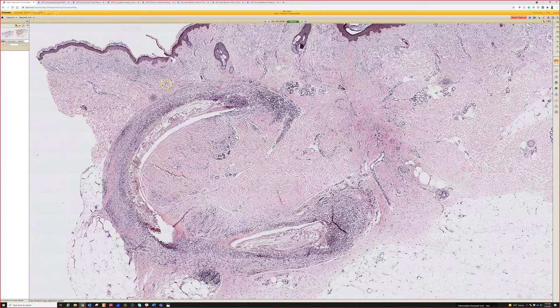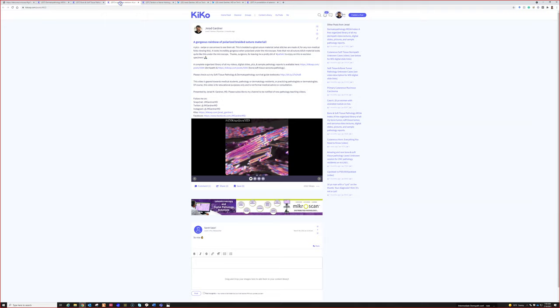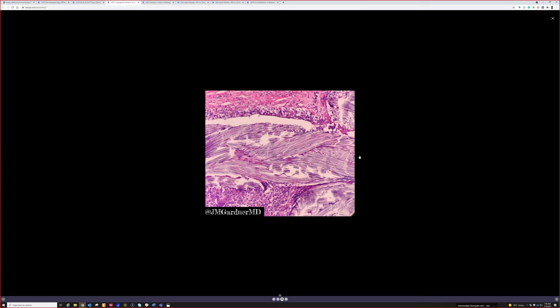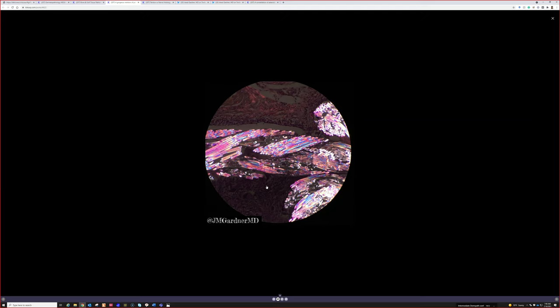I pulled up what it looks like when you polarize that braided suture. Not all suture will do this, but a lot of synthetic sutures give this amazing rainbow of colors when you polarize. For all the awesomeness of digital slides, to my knowledge you can't polarize. Here you can see something that looks very similar, and there's a little giant cell. Usually when I first show junior residents, I put the polarizer in and turn it and get appropriate oohs and ahs because of the rainbow of awesomeness.